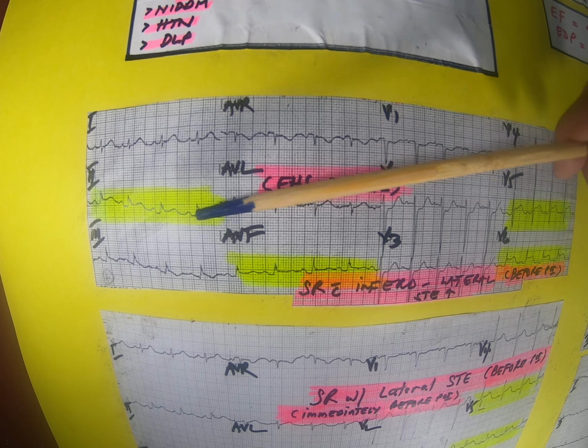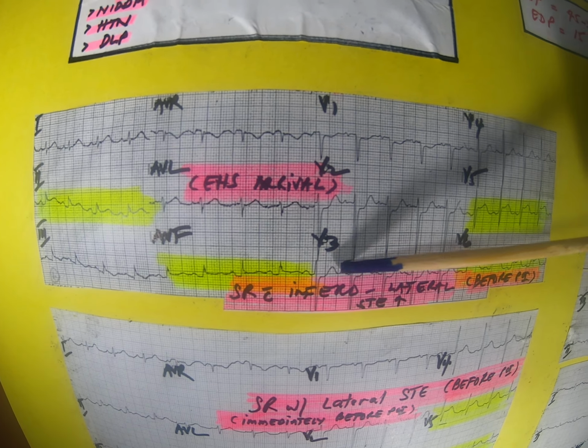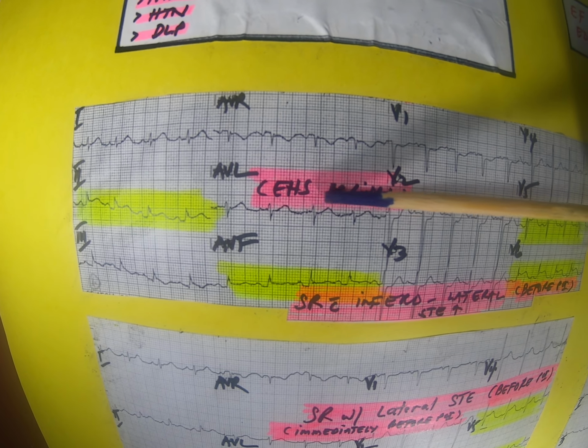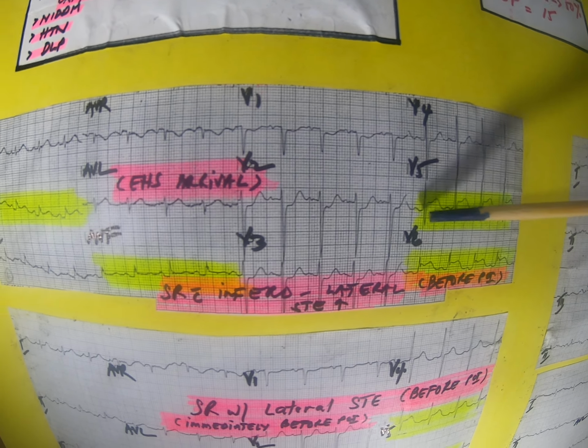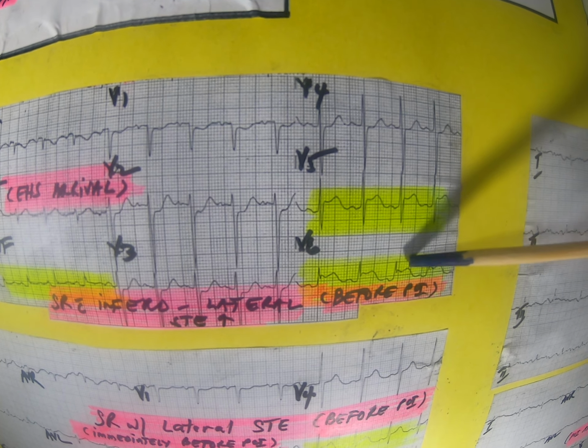So if we have an inferior STEMI, normally we have reciprocal ST depressions in V2, V3, and V4, or we could also have ST depression in aVL. Okay, but we have a combo here. We have an inferior ST elevation and lateral ST elevations.